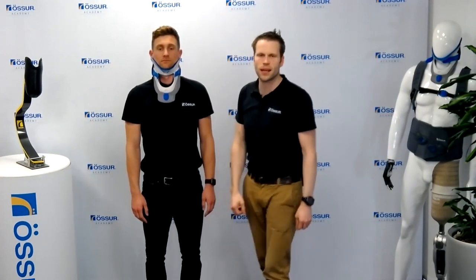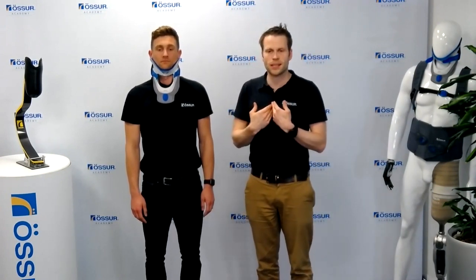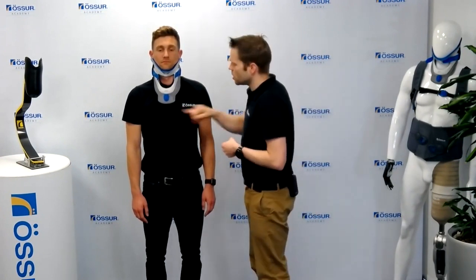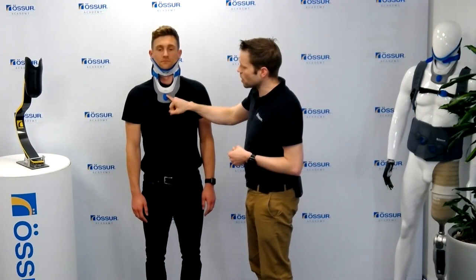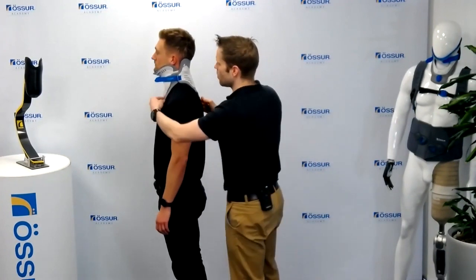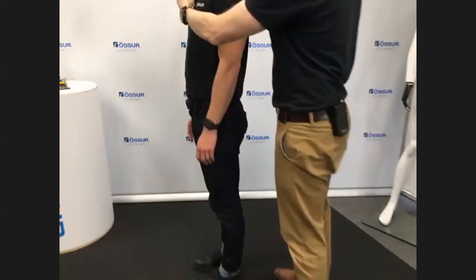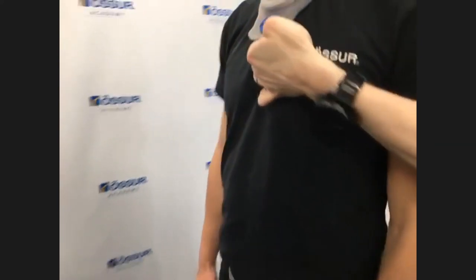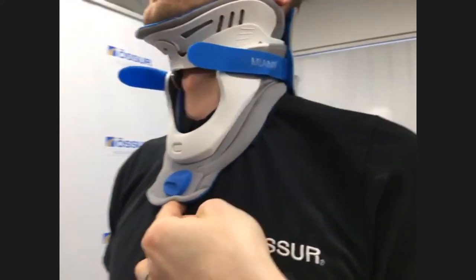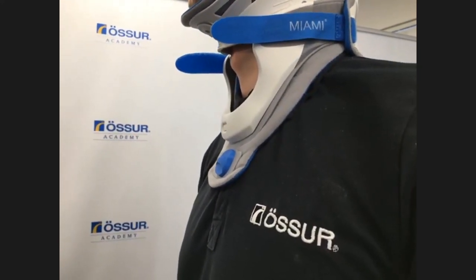You do sometimes get a little bit of movement effectively as the patient goes from sit to stand, just because there's increased axial load going through there. You can see that the sternal pad at the moment is locked, but if we go to the lateral side, if we move over to the dynamic camera, what we can actually do is unlock this section, and it gives a little bit more adjustment. So it can make it very useful when the patient is eating or when they're sat down.